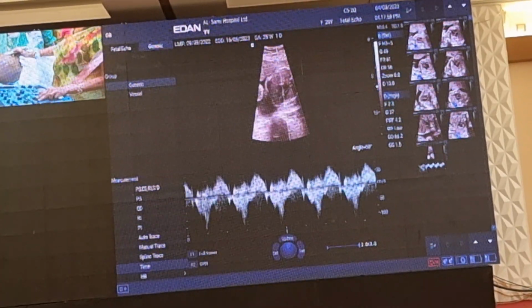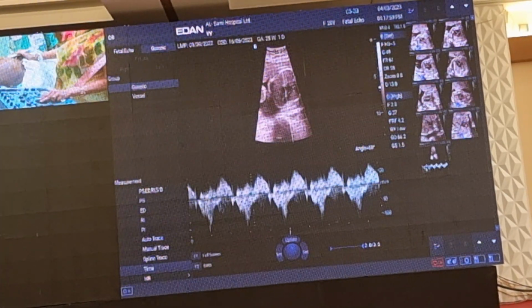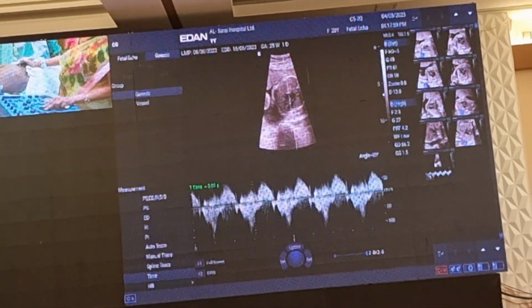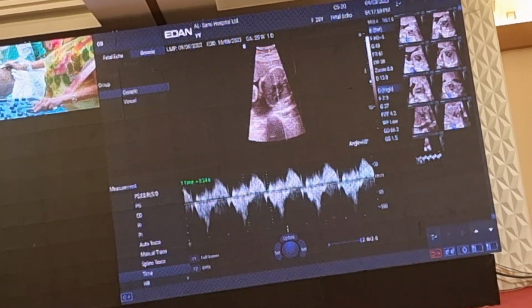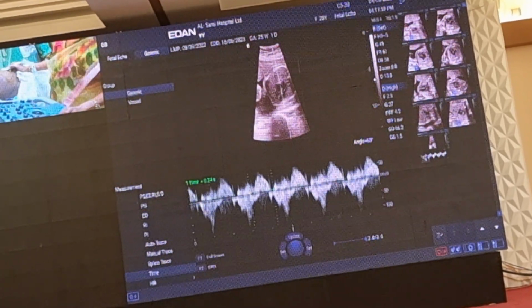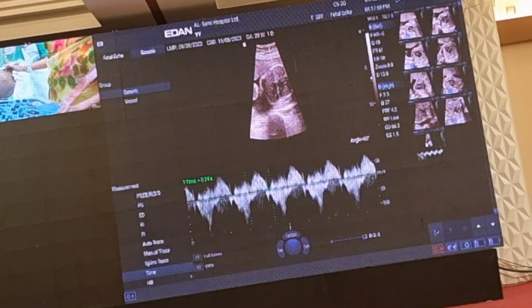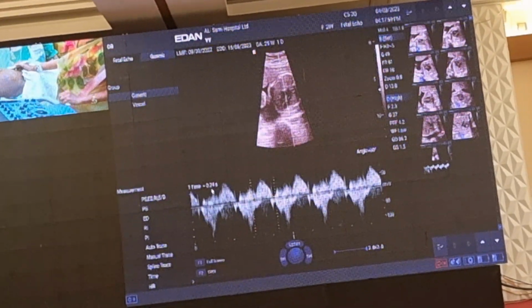So what we do is we measure the distance from the end of the A wave to the beginning of the E wave. Okay. So here the time reads 0.24 seconds or 240 milliseconds. See, here's the time, this is showing the time over here.